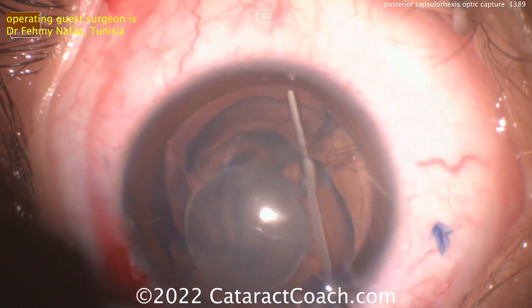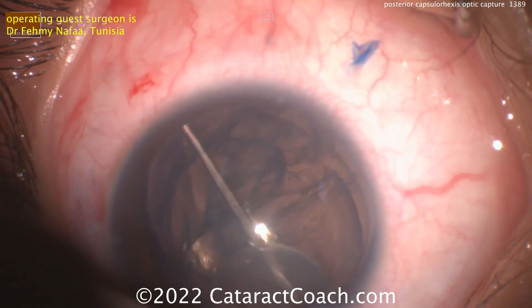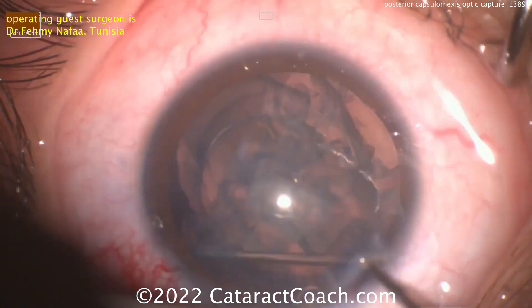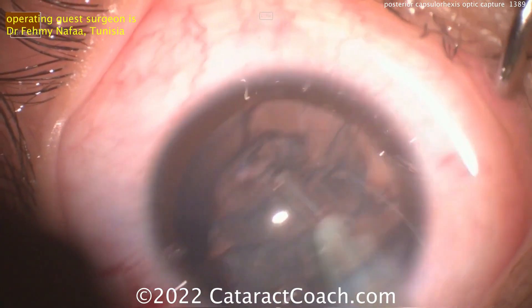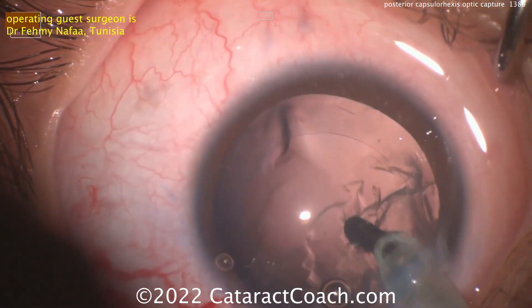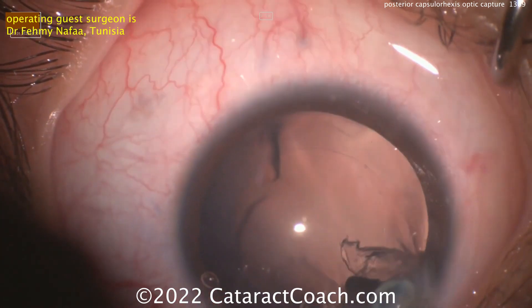A little hydrodissection is being done. The nucleus here is very soft — that's going to come out very easily. As you know, in these children the PCO rate is very high and very aggressive. In very tiny babies, you'll certainly do a posterior capsulotomy, but also even an anterior vitrectomy primarily, intentionally, to avoid that aggressive PCO. In this patient, however, you just need to do a posterior capsulorexis to clear that visual axis. The lens comes out very easily — just use the I/A probe, cleaned up quite nicely.